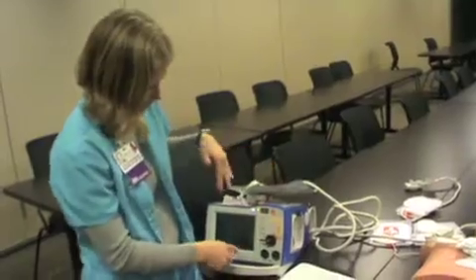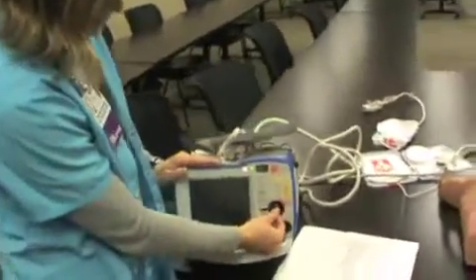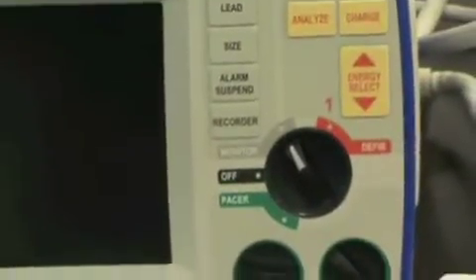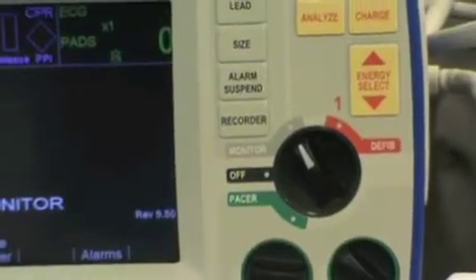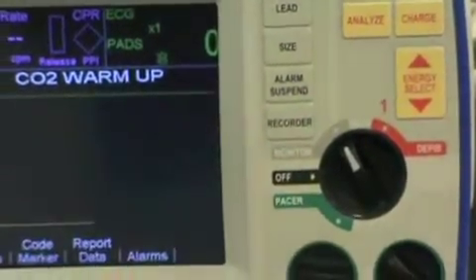Okay, let's go over the other functions of the front of the machine. So this is like the main dial. It's going to have one function of monitor. So you could use this, like if you're going to transport a patient and you just wanted to use it as a monitor, you can use it as a monitor this way.